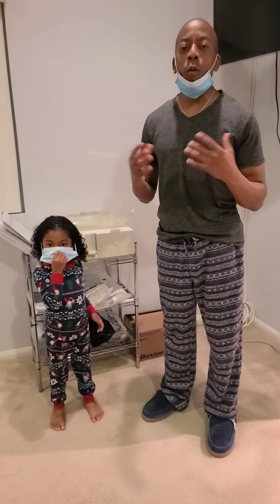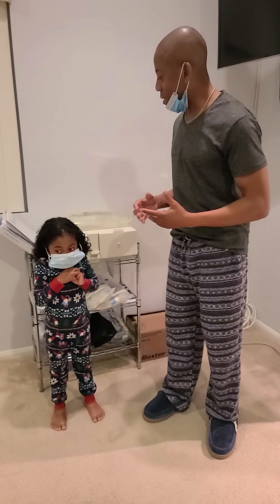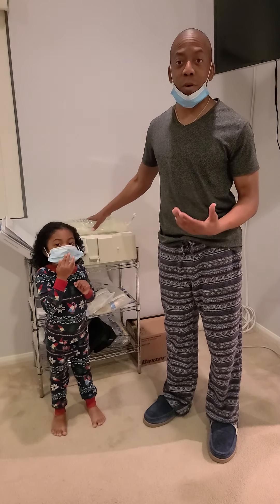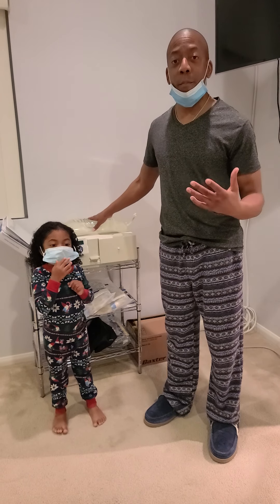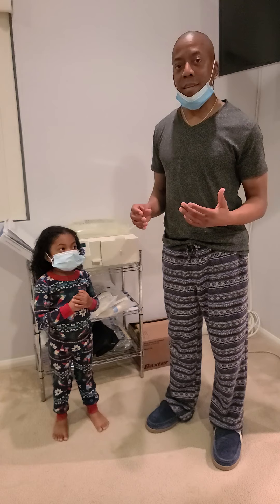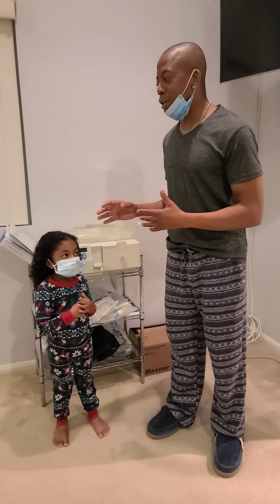Hi, I'm Maury Saprek. One of the things I want to do is to show people what it's like to go through the process of using what we call PD. This is a home dialysis treatment. As I go through my own journey of dealing with a type of kidney disease called FSGS, which is scarring of the kidneys, I want to go ahead and show what the process is.